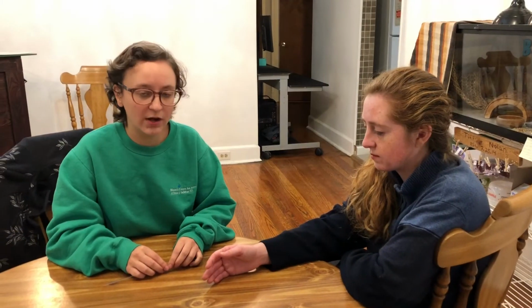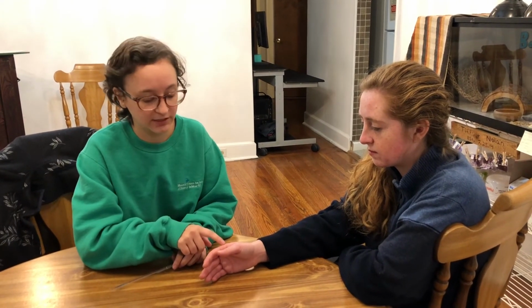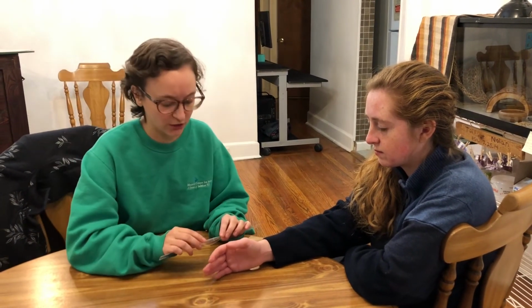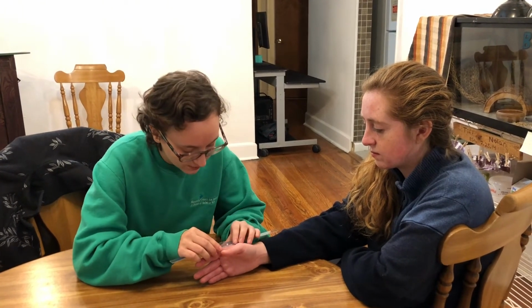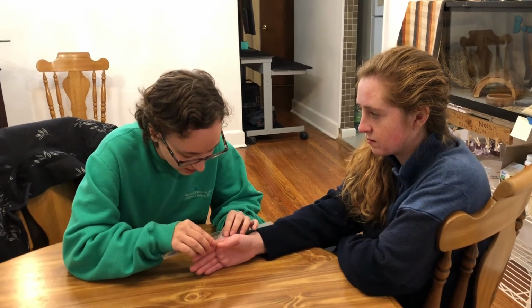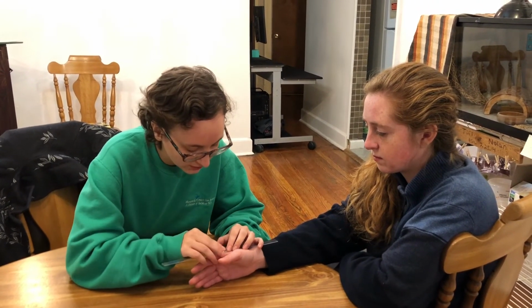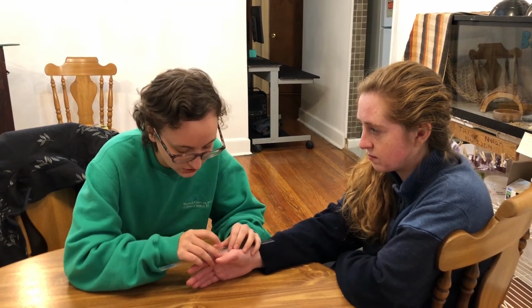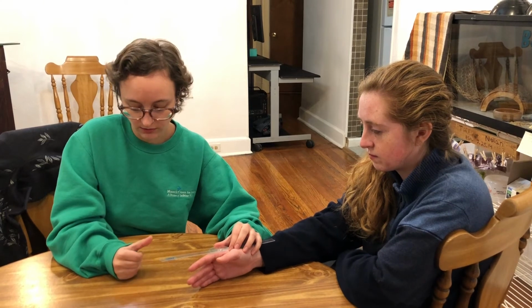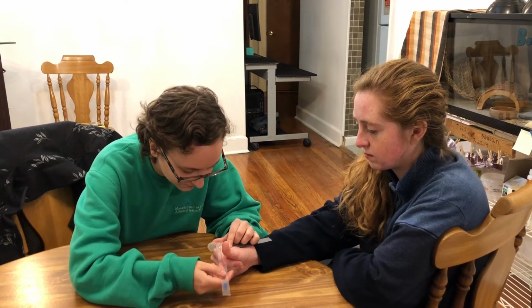Now I'm going to do goniometry measurements of the fingers. I'm going to start first with the MCP joint, and we're going to start off with flexion and extension of the MCP joint. So I'm going to put my fulcrum over top of that MCP joint, and I've got my movement arm in line with her first finger and my stationary arm down the hand and into the wrist. So what I want you to do is flex your fingers like so. Okay.